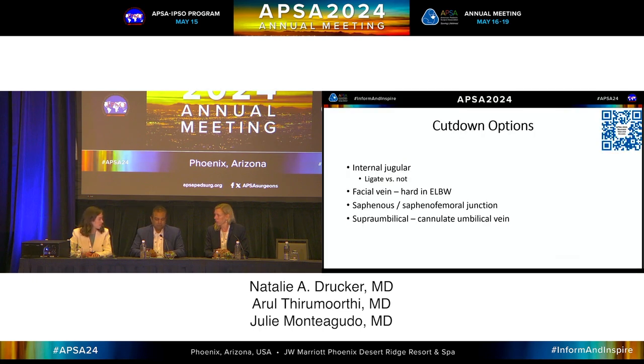All right, so Arul, I think now we'll talk about the options. It's not something that everybody's thinking about, particularly if you've graduated more recently. So, cut down options, the most popular, as Julie mentioned, is internal jugular. If you think about it, I think most people in this audience are comfortable doing IJ cut downs for ECMO. It's the same incision, it's the same access technique. You're going above the clavicle, you're cutting down, isolating the jugular. You'd still put ties on it. You don't have to ligate it.